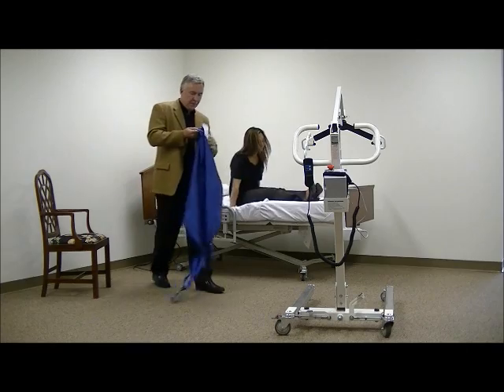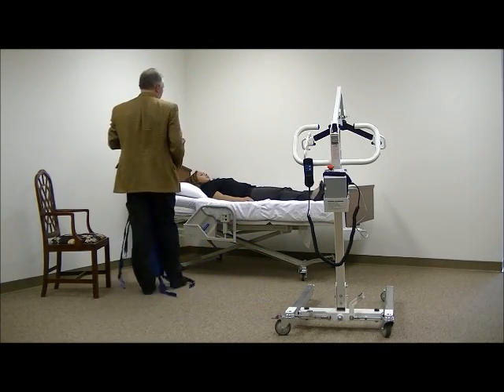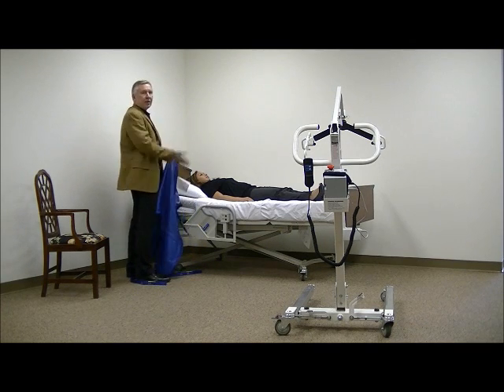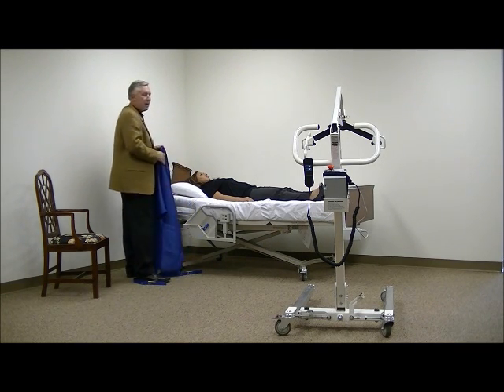So go ahead and lay down. And you can see here that when a patient's laying in bed, you're not going to be able to simply tuck the sling under them instantaneously. You're going to have to roll the patient from side to side.